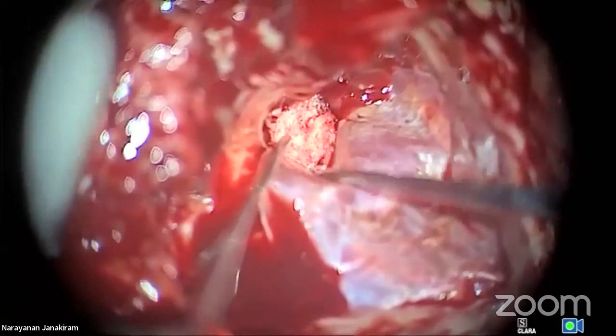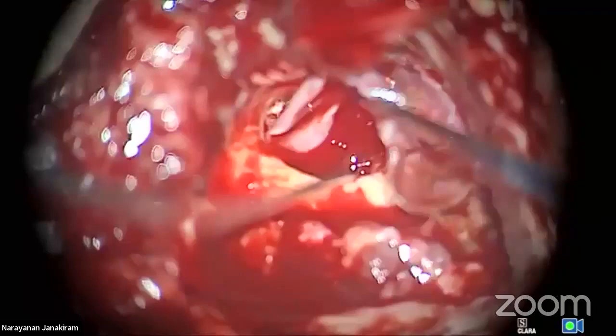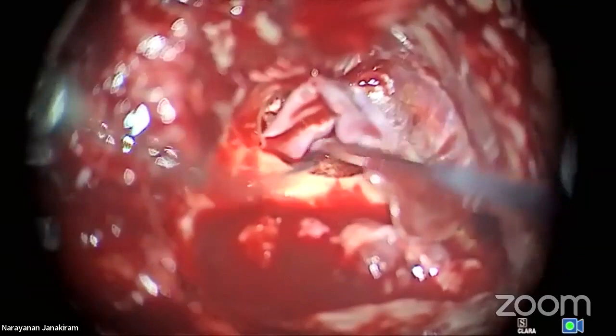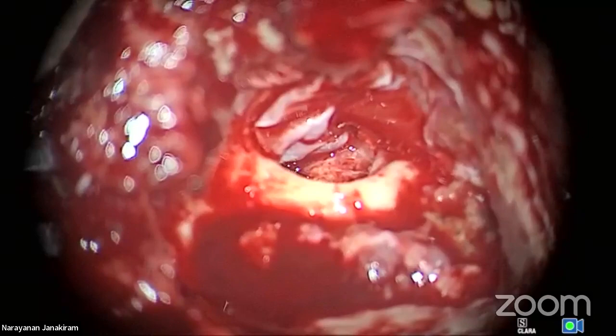Now what I will do is elevate this and keep a small cartilage strut like a type 3. See, if I damage the middle ear mucosa, it's a different one. Now I have not damaged it. So you can beautifully keep it here. I'm going to just keep one in the hypotympanum just to create a middle ear space. See that? Can you see it, my dear friends? Cartilage.